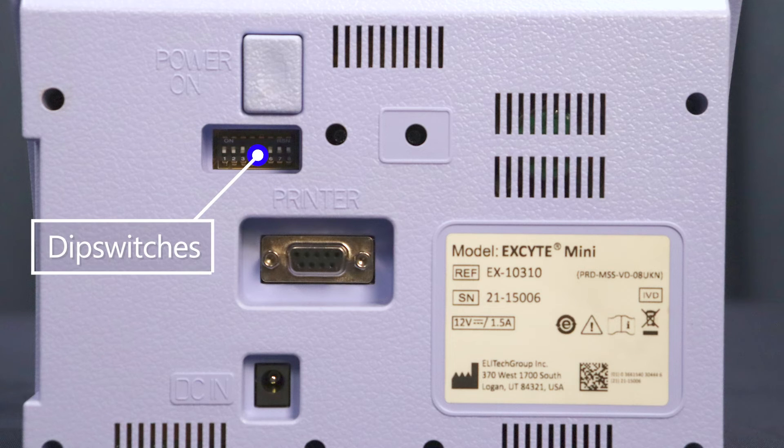DIP switches are located on the back of the unit to control settings such as test time and temperature correction, in addition to defaults for the printer, internal fan, and graph generation.